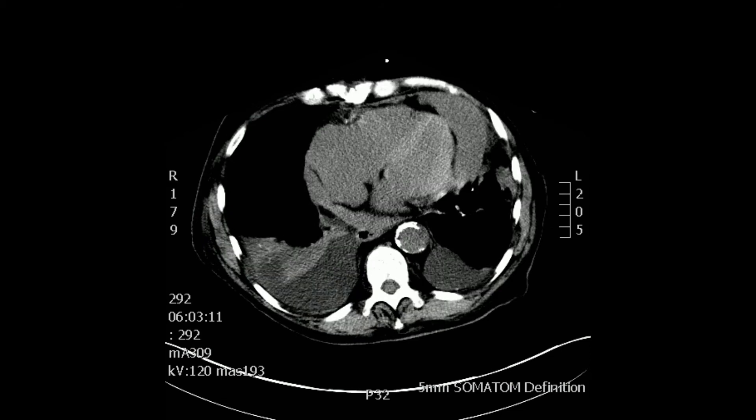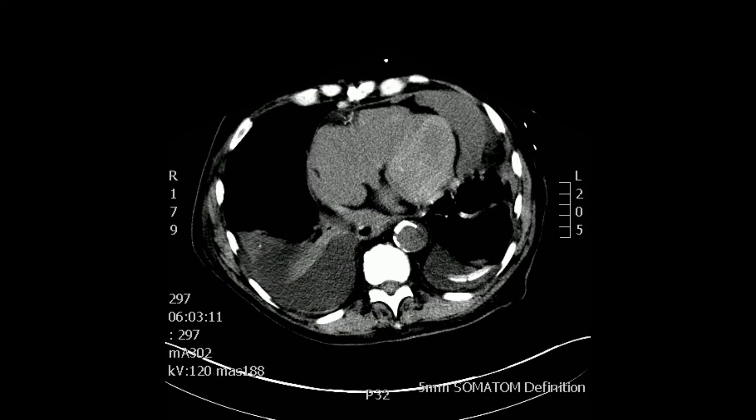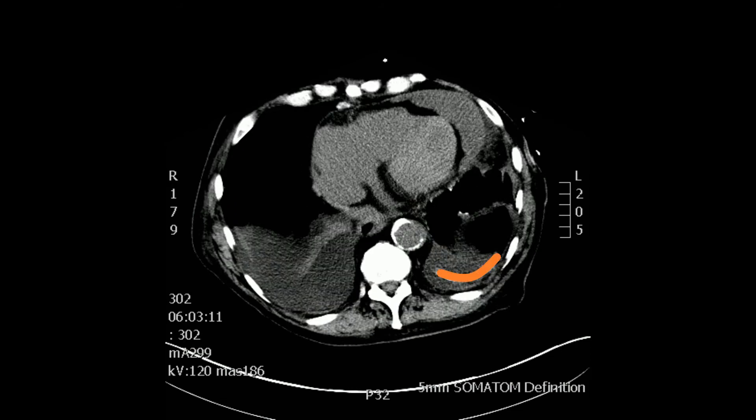Continuing to move distally, you can see the descending thoracic aorta, heavily calcified. The patient also had a pleural catheter to drain a left pleural effusion, shown in orange. You can see the catheter inside the left pleural effusion area.